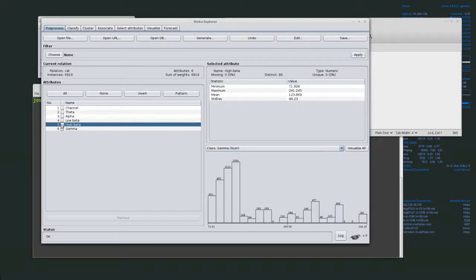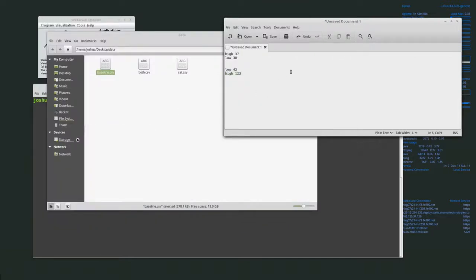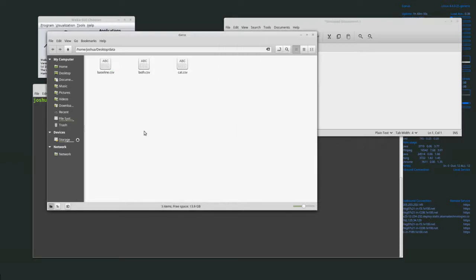I'm going to focus on high beta specifically and see if I can make a classifier that differentiates between not looking at a cat versus looking at a cat. One of the things we're going to try today is clustering — to see if we can detect the differences automatically. I want to focus on high beta because there's a big difference in the mean; for low beta there's a little difference but it could just be noise.